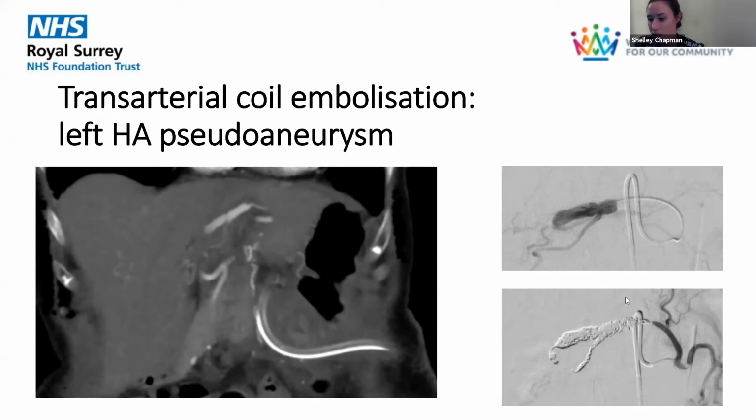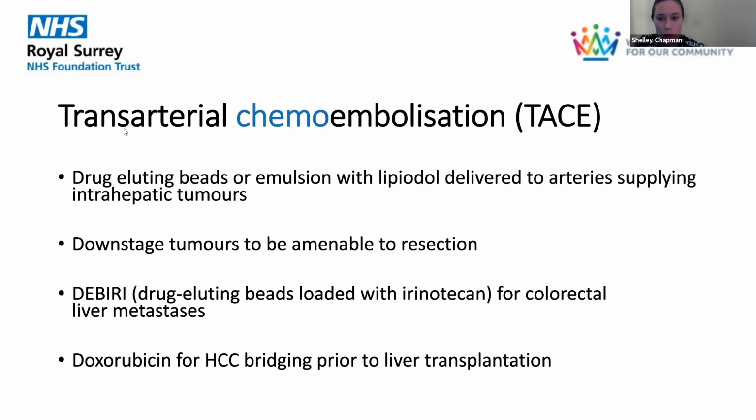We inserted a sheath into the femoral artery, a reverse curved catheter into the celiac axis, and then a microcatheter through that. Injected some contrast and confirmed what the CT showed. And to treat this, we inserted coils firstly into the normal blood vessels, the normal branches off of the pseudoaneurysmal left hepatic artery, through the pseudoaneurysmal segment and then into just the proximal part of the artery. And this contrast enhancement at the end showed that collateral flow was preserved and the patient recovered fine.